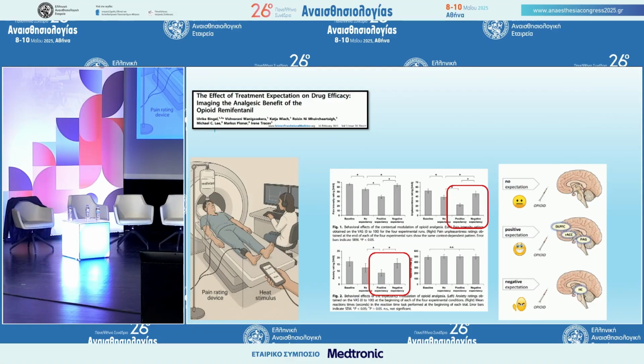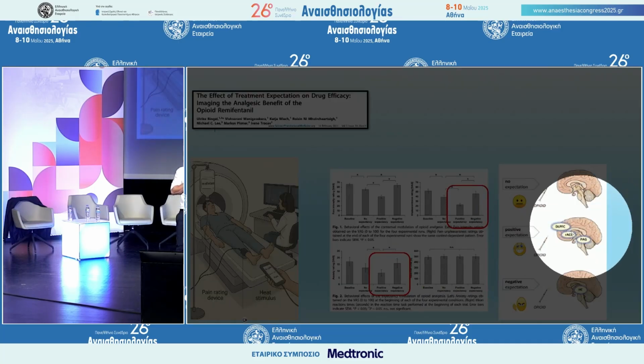And after that, we have 2 remaining measures. First, neutral. I am giving remifentanil and I'm measuring the pain, and it's not changing anything. But more than that, I can tell my patient, we're stopping giving you something to help. Now you just have pain, but we continue to give remifentanil. So according to the way I'm talking to my patient, I have different consequences. And because we are under MRI, we can do a functional MRI and we can see that we have different areas of the brain.